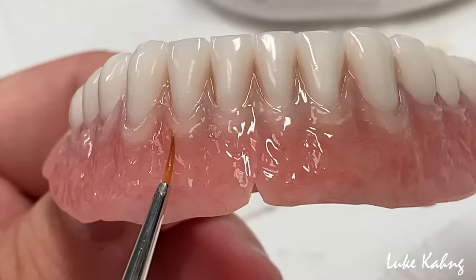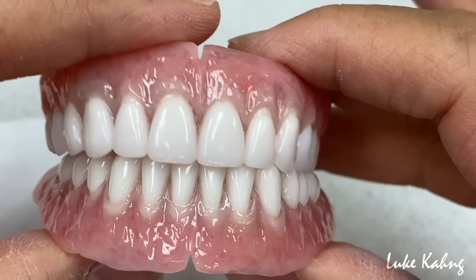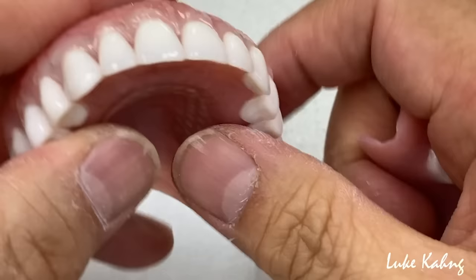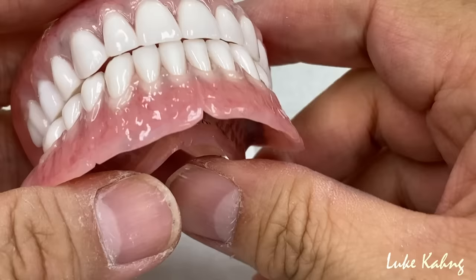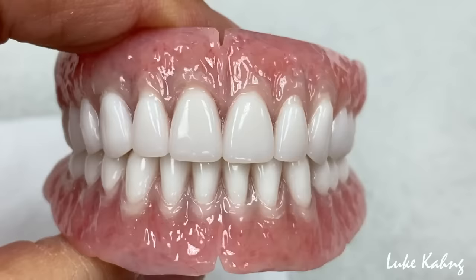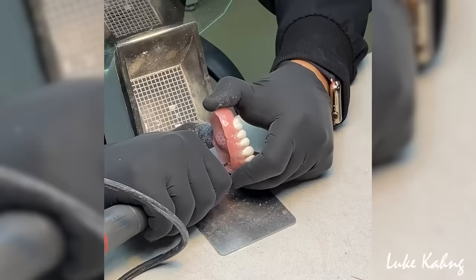The case has these characteristics, with the metal mesh underneath and the bleaching teeth color. So we're going to try it in the patient's mouth soon. This one came from this. The new look. Dr. Emilio here. We trim the dentures with live patients.